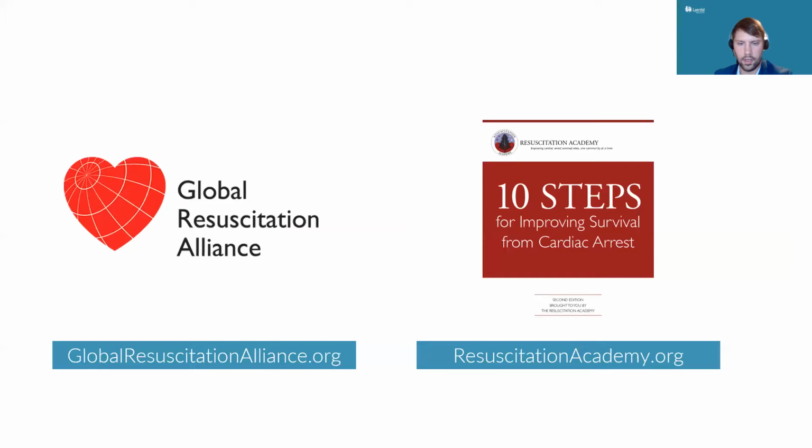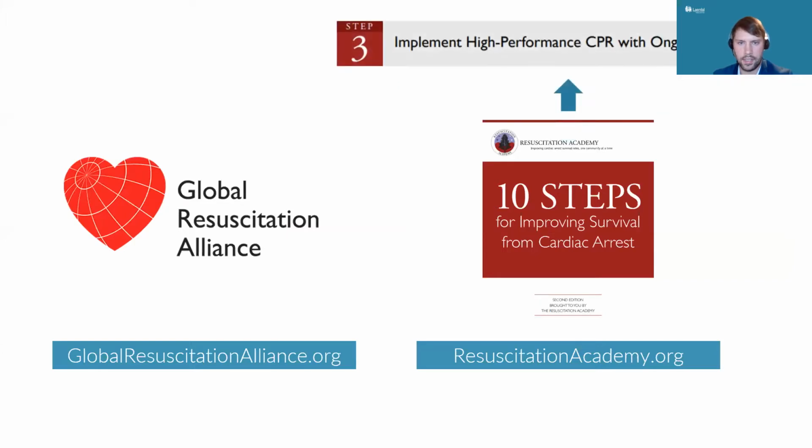why it's important. So high performance CPR is actually one of the Resuscitation Academy and Global Resuscitation Alliance's 10 steps to improve survival from sudden cardiac arrest. So when we look at regions or communities that have some of the highest survival rates in the world, often those organizations that are responding have implemented high performance CPR with ongoing training and quality improvement.